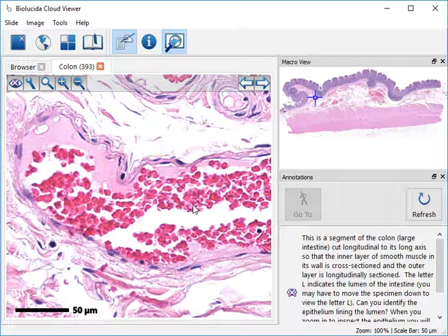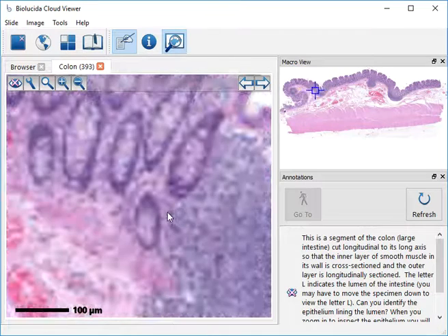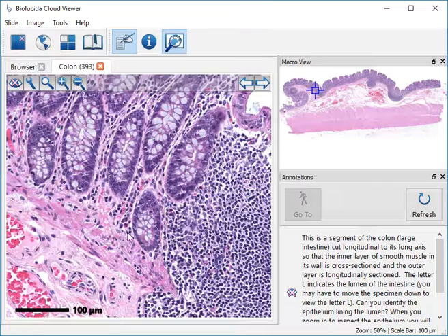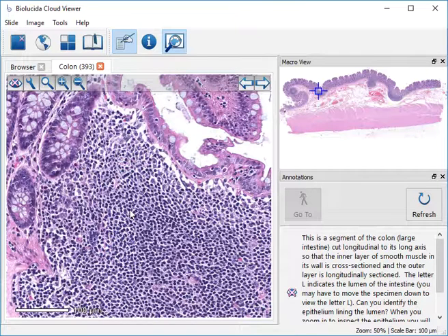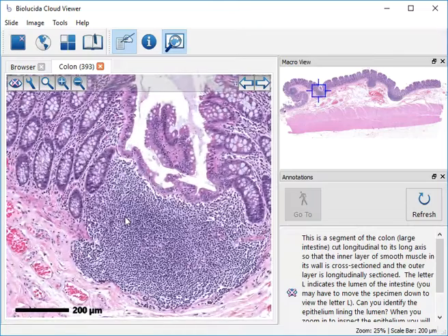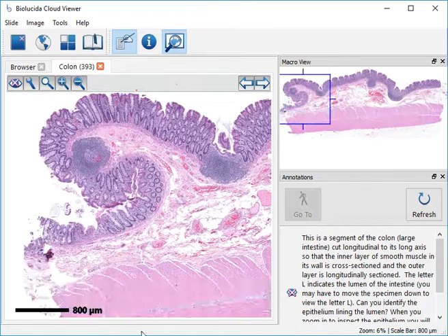Always keep in mind the size of things, because we're looking at shape, size, location, context, and function. That's what histology is all about, recognizing patterns and then learning the details of those patterns, what makes those patterns look like they look. Like here, you see the basophilia. You would immediately suspect lots of nuclei crowded together. Okay, so I think that is all I'm going to say about this. Hopefully that'll give you a good orientation.